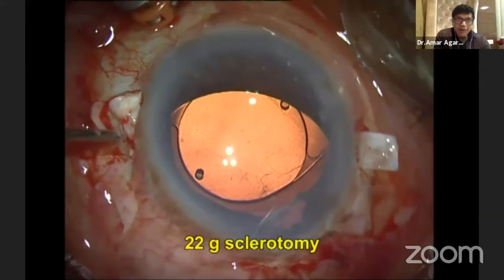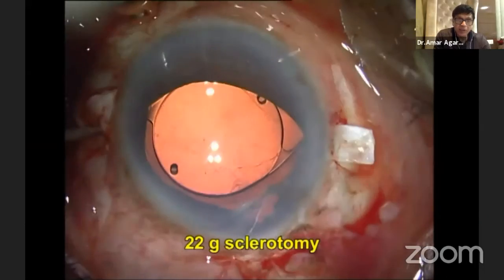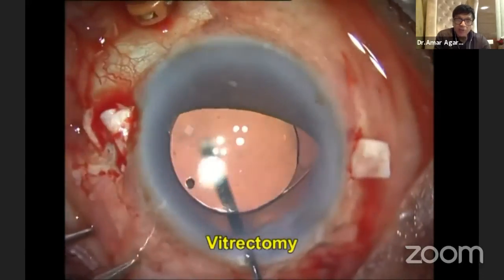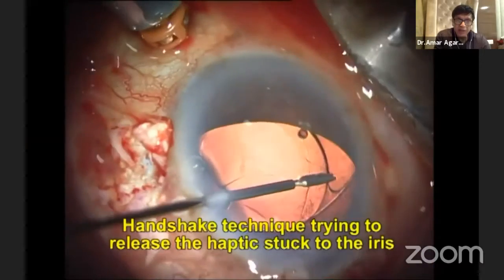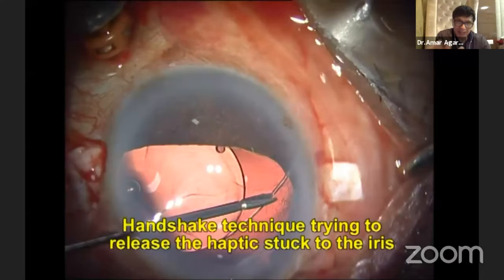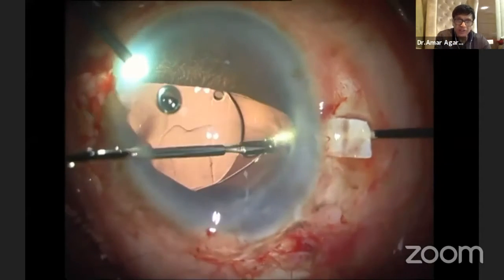You can see someone has implanted a PC IOL in the AC. I made my scleral flaps. My game plan is after the vitrectomy, which you see I'm doing, to move the same IOL from the AC into the PC.